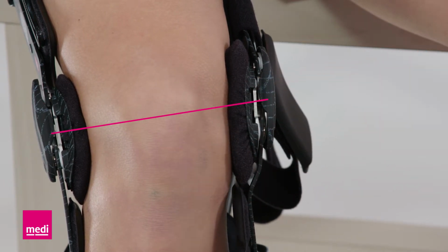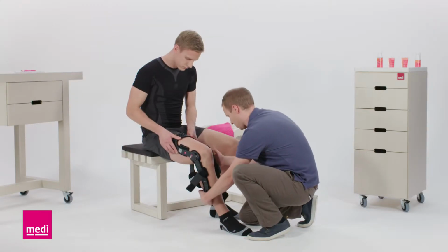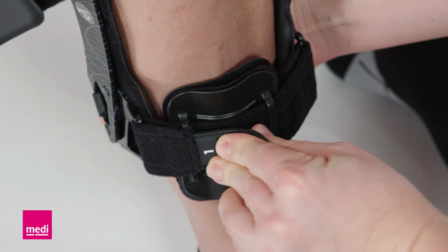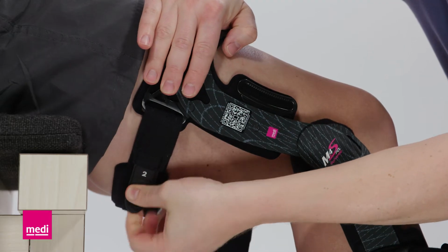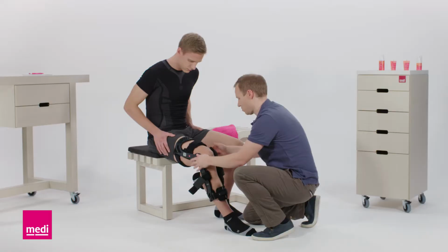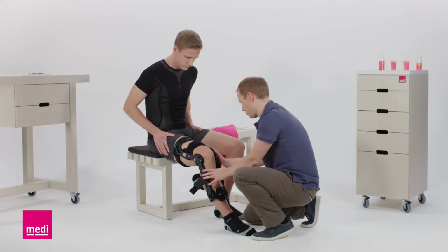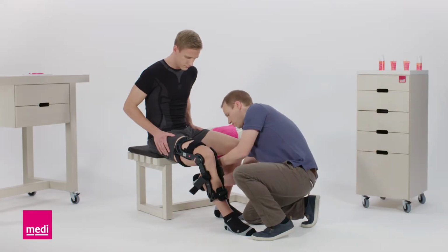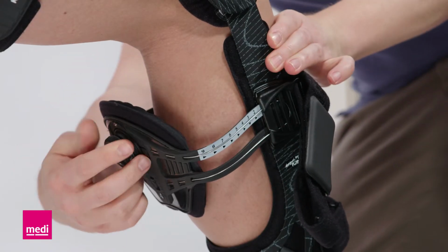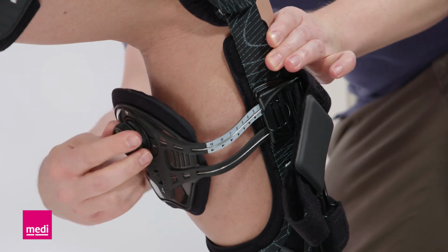The belts should be fastened in the correct order to ensure an optimal effect and a secure fit for the orthosis. Ensure that the hinge is located behind the lateral center line of the leg, and check that the hinge is still positioned on the knee and that the orthosis has not become contorted. Ensure that the tensioning dial has been pushed back inward to activate the tensioning mechanism.